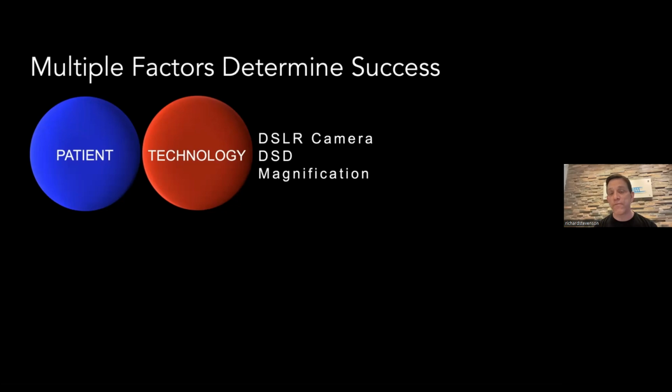I've been in the 5 to 6 range for 25 years. And it's not because my vision needed it, it's because I wanted to see more. And then I also use a microscope. So when I'm refining margins, the microscope is really helping. You're like, well, great, I can't afford a microscope right now. Don't worry. Your first step is to move into the best loupes in the world, buy those loupes, and then you can say to yourself, I'm doing what I can do at this time in my life.